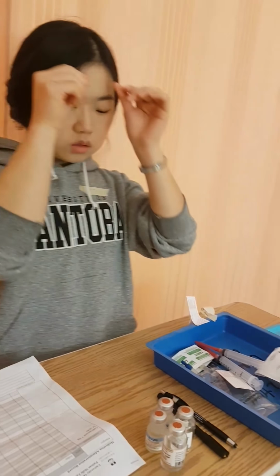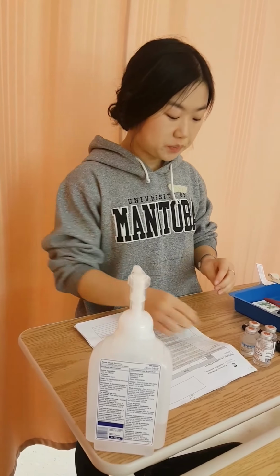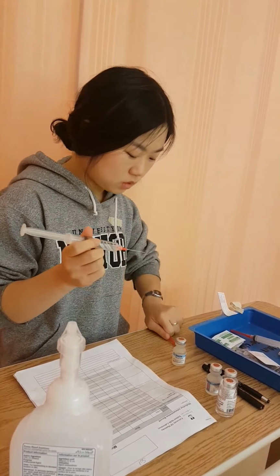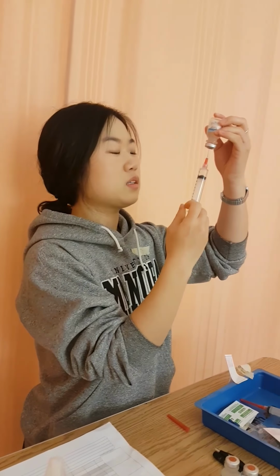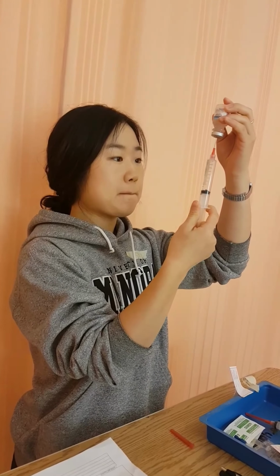Okay, so according to the PDM, I need to add 9.6 milliliters of sterile water. So I'm going to draw up 9.6 milliliters. Inject it, and then collect it. Okay, being careful not to touch the tip.